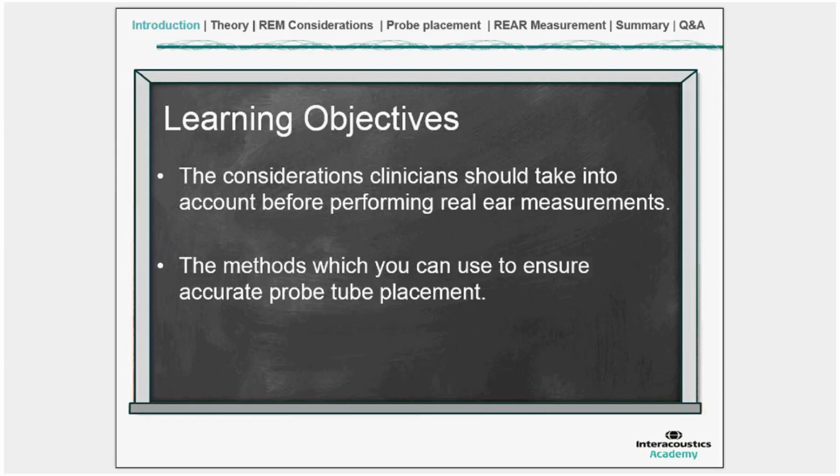The second thing I want to spend a little bit of time on is talking about how you can insert the probe tube. Firstly, so that it's in an accurate position, so the measurements which you take are going to be proper. But secondly, to overcome the myths which some audiologists have of the fear of putting it in. Of course, audiologists are putting impression material in the ears every day to take ear mold impressions, and this probe tube insertion is a much easier task than taking an impression. So I will overcome the myths and give you some advice on how to put the probe tube in.